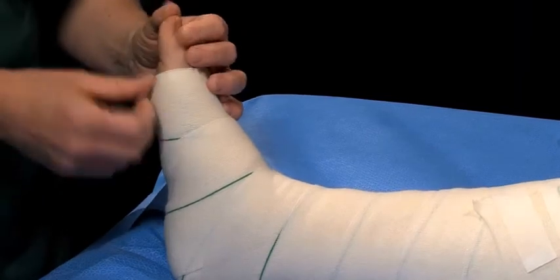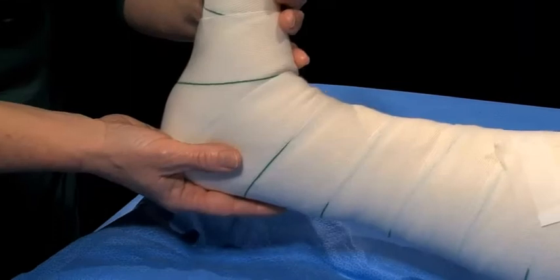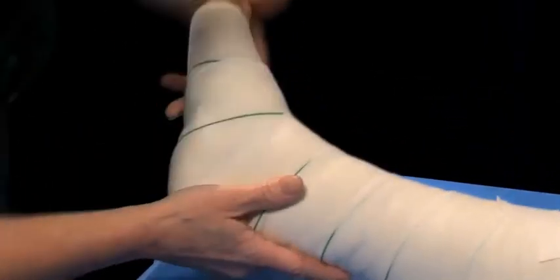Ensure that the individual has ankle and foot movement, and their toes are well perfused after bandaging. Observe for any gaps in the bandage, which may indicate poor alignment.